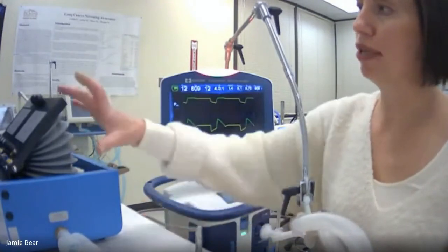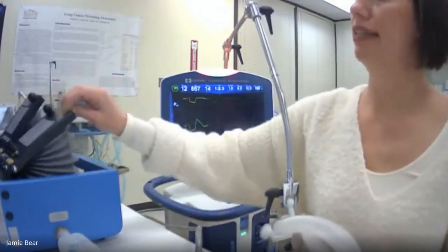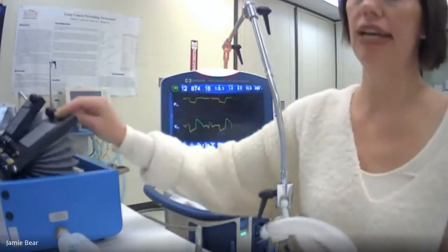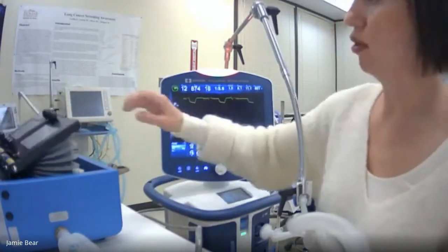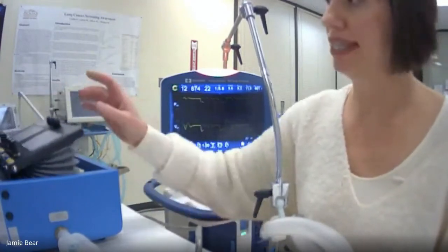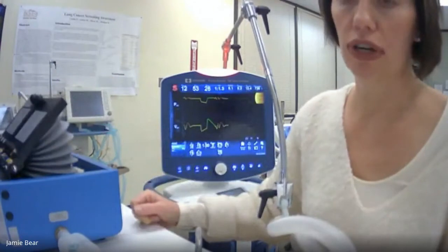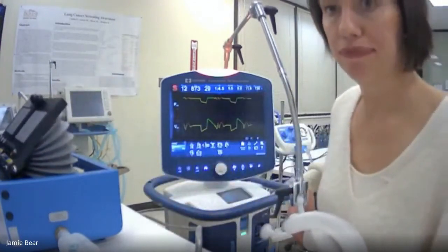Okay, but now watch what can happen if the patient wants to breathe spontaneously. Okay, so they took a spontaneous breath. You'll see that they'll be able to do that, and it's like they're starting at the baseline and at the high level. So they're just breathing at the high level, which is still their baseline, and then if they want to breathe over at the low level when they're down there, then they can do that as well.